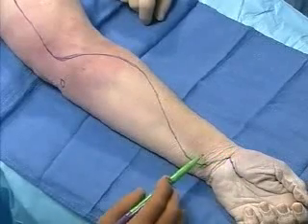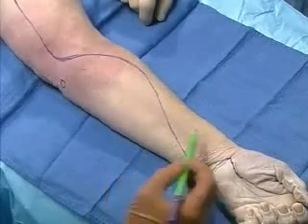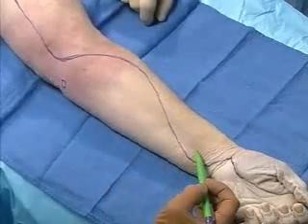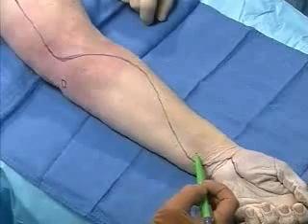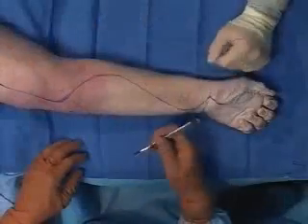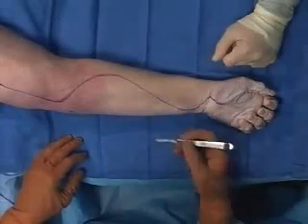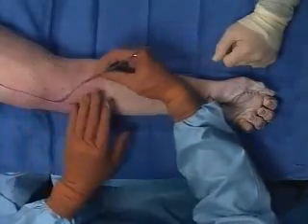It's also not a bad idea to have a skin flap at the wrist that can be laid across the median nerve and flexor tendons, particularly when you're not going to close the skin incision. So what we've done, we've laid our incision as if we were going to do the entire upper extremity, and then we'll begin our incision here at the elbow.